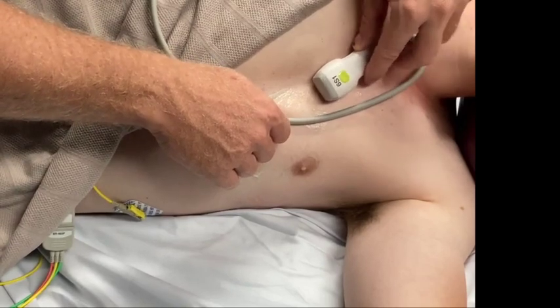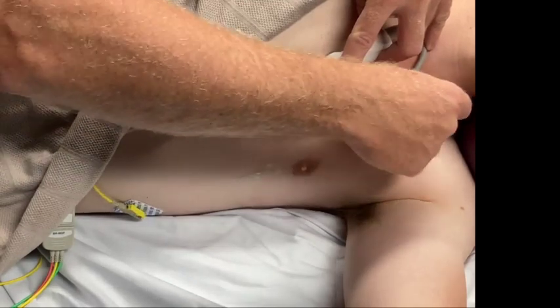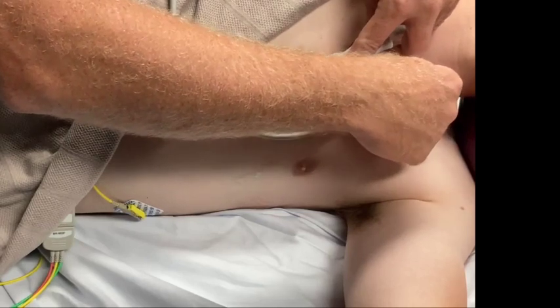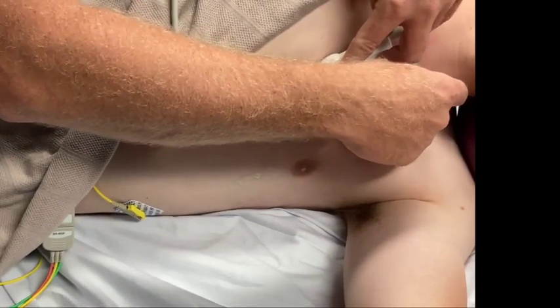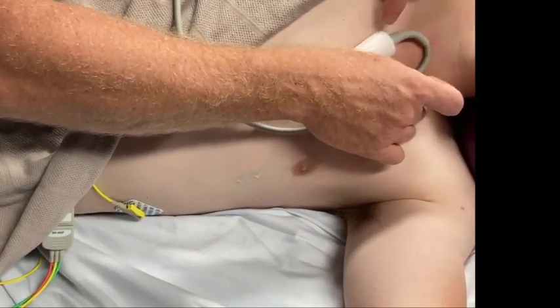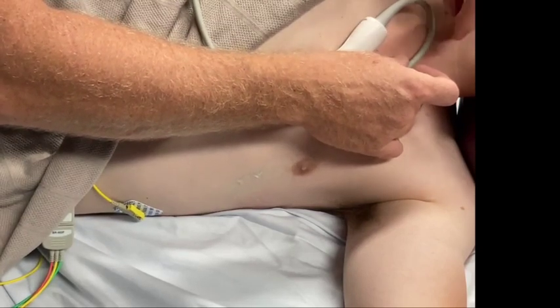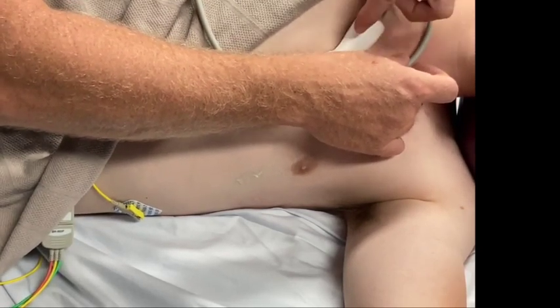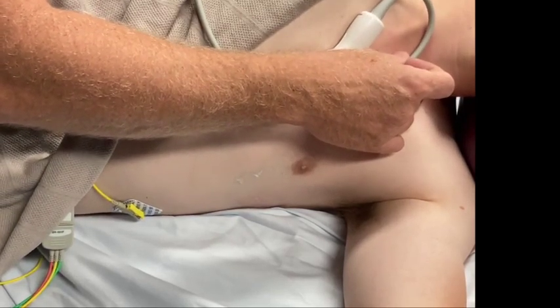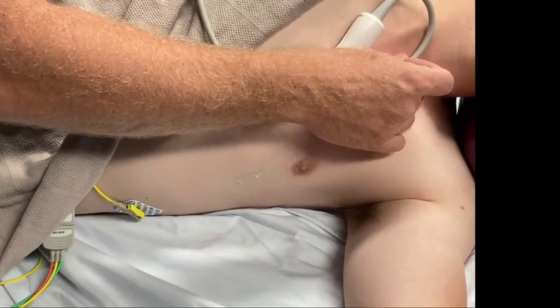Now, as we get older, as I said, the aortic valve is the face of the transducer and it's fixed in there. It's also fixed at the ligamentum arteriosum, which is where a PDA would be if we didn't have that cleared off. So it's fairly fixed through there. So if we increase the length of the aorta as it dilates, to fit in that same spot, it needs to change that angle, and you can see now the face of the transducer, instead of heading straight up the sternum, is now heading across the sternum much further towards the patient's right-hand side. Now that's going to be really important to us as we're imaging the aorta and knowing which way to track along.